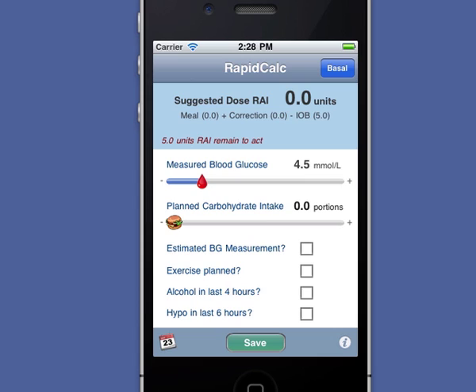If I find my blood glucose level low before going to bed, I can use RapidCalc to work out how many carbs I need to raise it to a safe level.